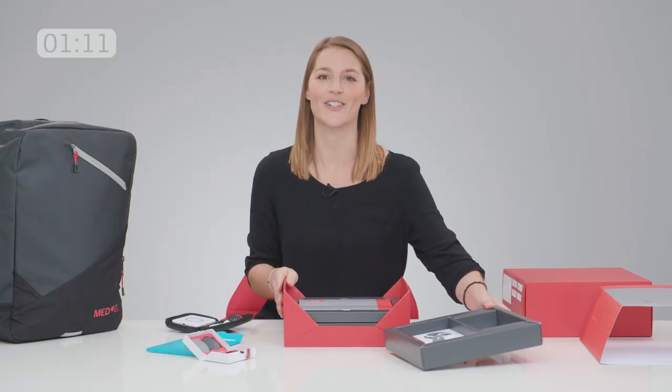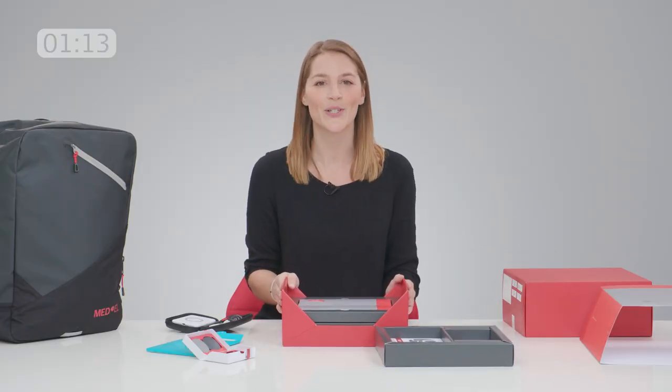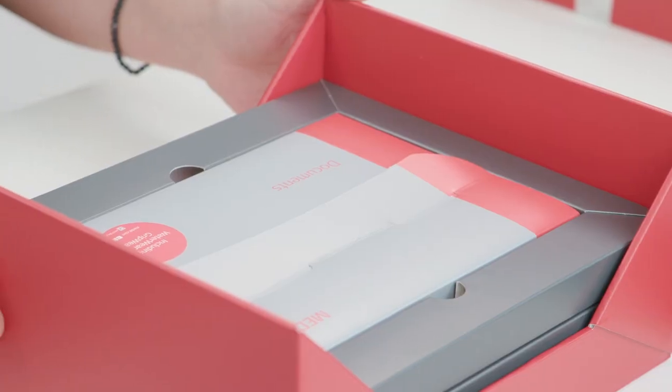No device is without its documents. There's lots of important product information in there, so be sure to look through it all.